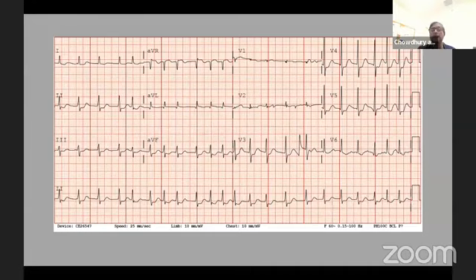Yeah. So here there is ST elevation in aVR. Patient is in AFib, and there is global ST segment changes, right? V4, V5, V6, and then leads 2, 3, aVF. So the ER said, well, this is left main, like I showed you earlier in another patient, right? And they're saying you should do the cath.